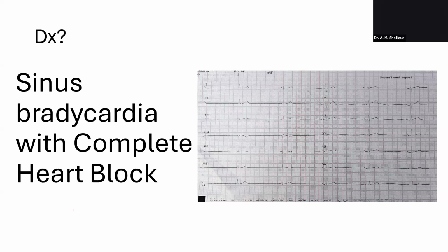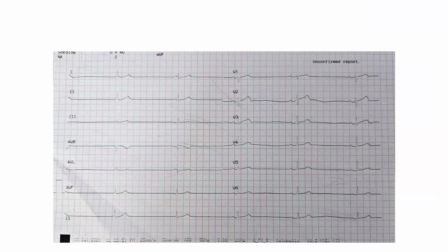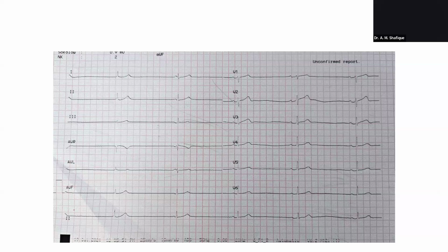If there is no AV nodal problem, there should have been some capture beats. In that case, the rhythm would be irregular. Sir, if we look at the last episode, the last QRS, and the P before it, and the PR interval of that QRS and the PR interval before that QRS is almost the same. But not the same, nearly the same.